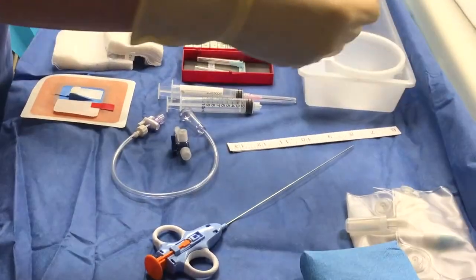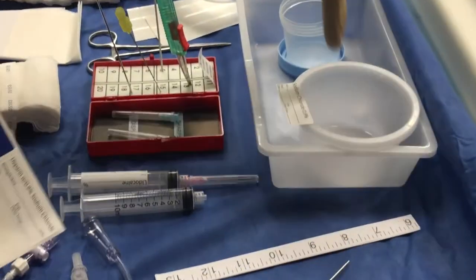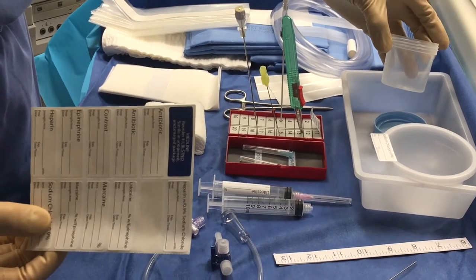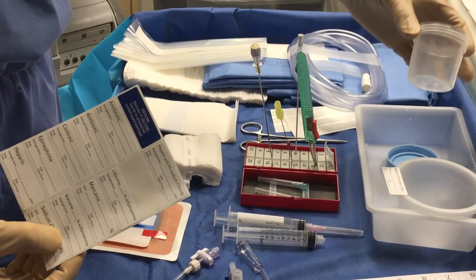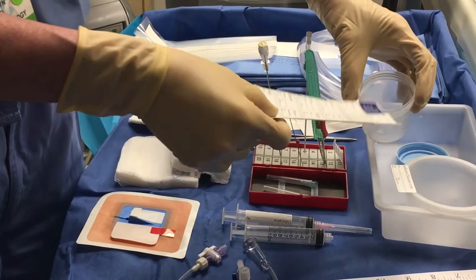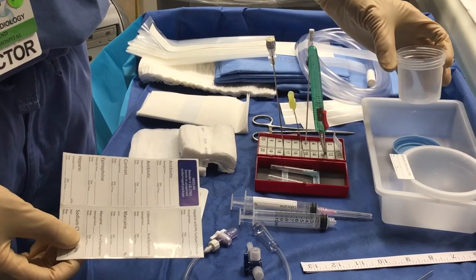This is our selection of labels. We peel off a sodium chloride label to put on our saline dish and fill it with normal saline for most procedures. This small container can be used for saline — for example, if you want to take a core biopsy and submit it for flow cytometry, you may submit it in saline. Or if you do a fine needle biopsy and want to submit a cell block, put aspirates into the saline and send it to cytopathology to spin down into a cell block.